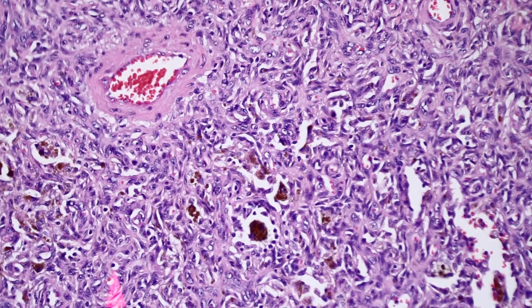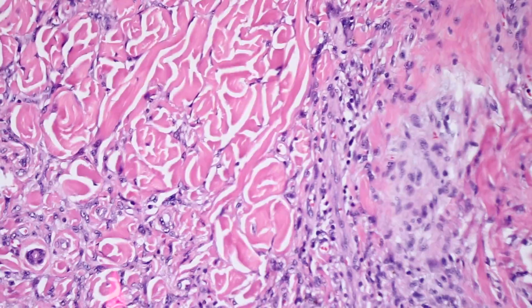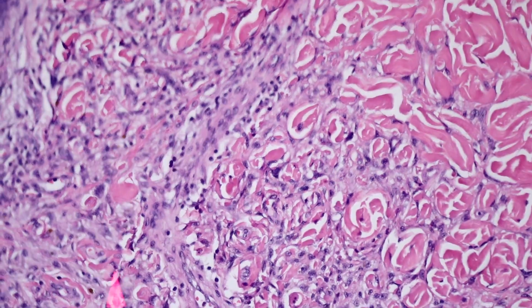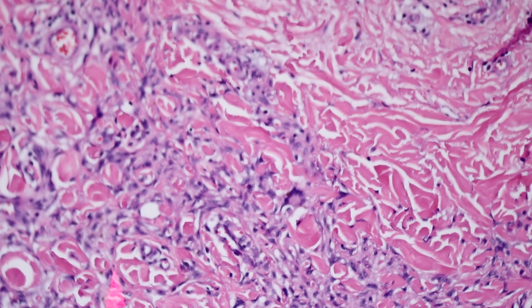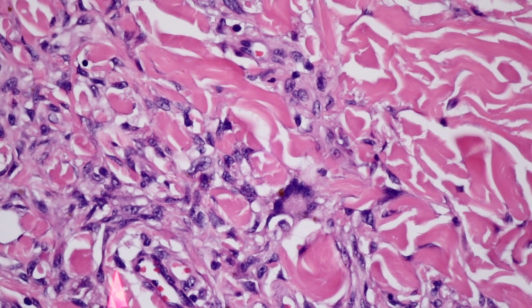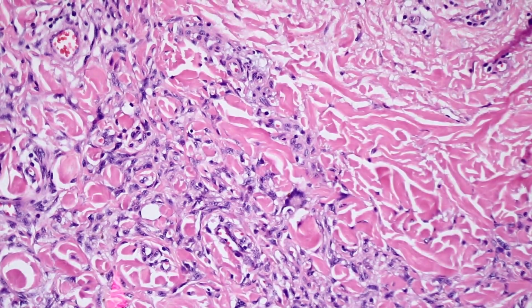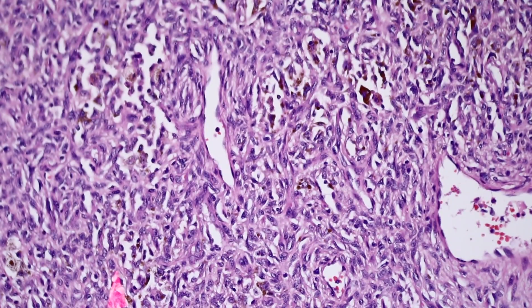Giant cells can be seen in any sort of dermatofibroma, but they tend to be more abundant and prevalent, I think, in these hemosiderotic or aneurysmal forms of dermatofibroma. Somewhere over there it is. Here's one right there. And they tend to have the wreath-shaped arrangement of nuclei, often with a little foam on the outside. So they're usually Touton giant cells. They may be scattered, they may be abundant, but histiocytic giant cells are a common finding in dermatofibromas, particularly the ones with hemorrhage and abundant hemosiderin.